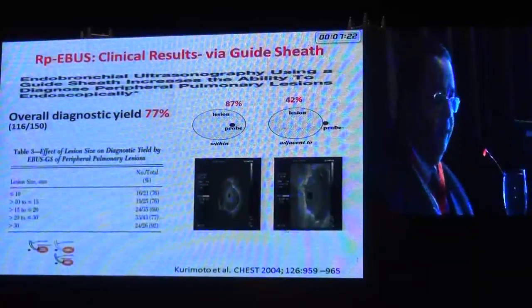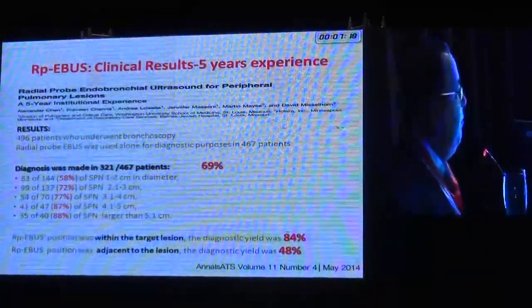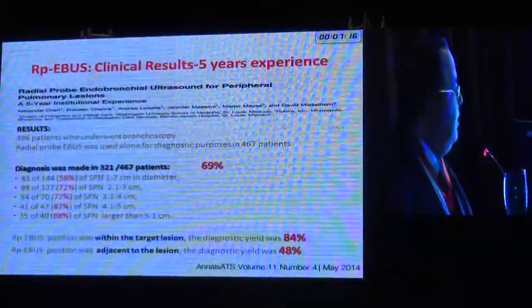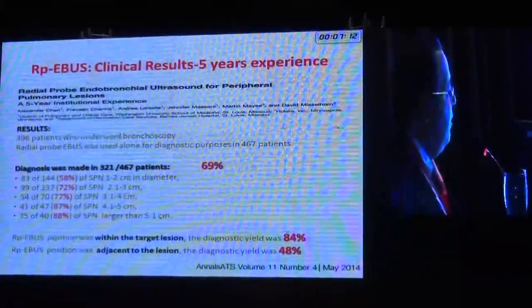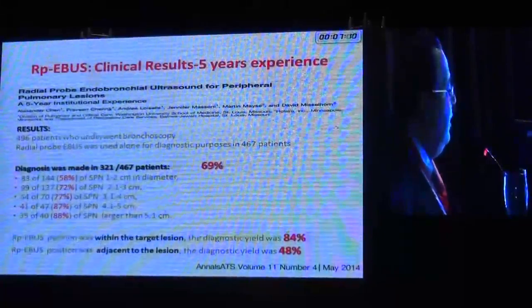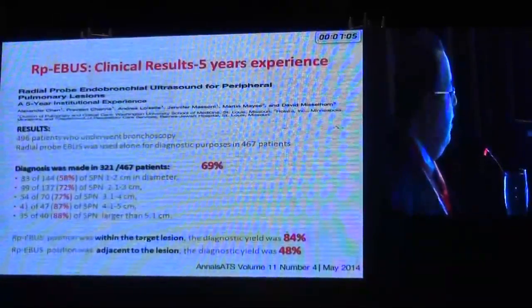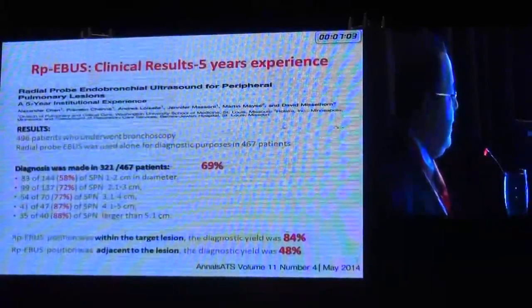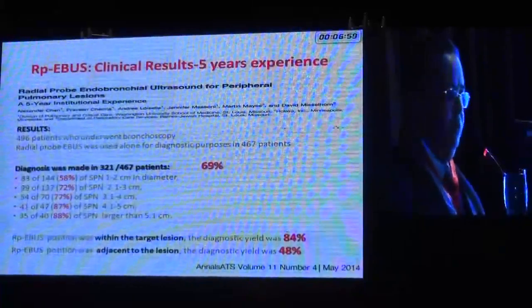This is a 5-year experience from St. Louis, Missouri. They had 467 patients. Their diagnostic yield was 69%. They reached a good diagnostic yield of 84% when the EBUS probe was inside the lesion, while 48% when the probe was adjacent to the lesion.